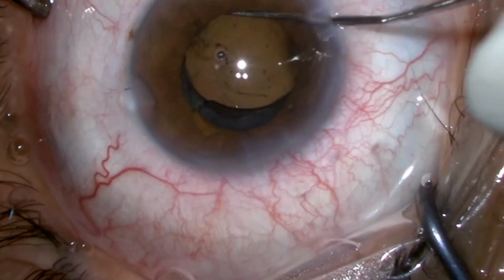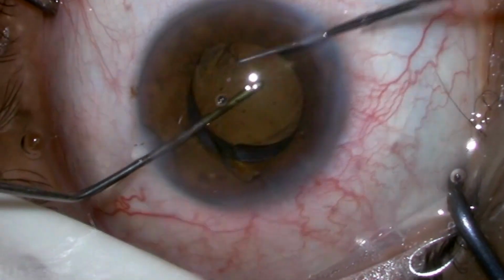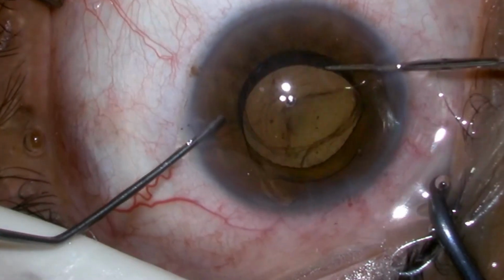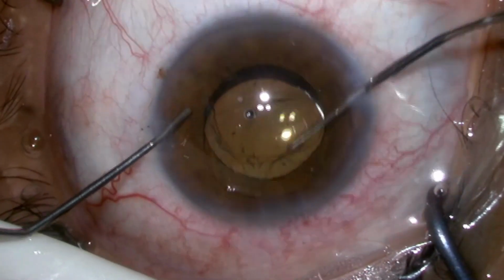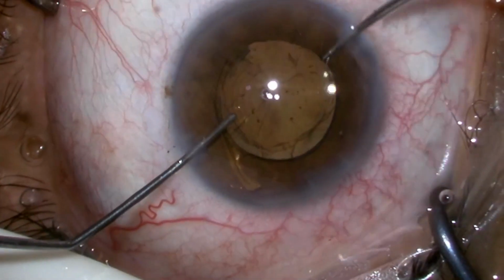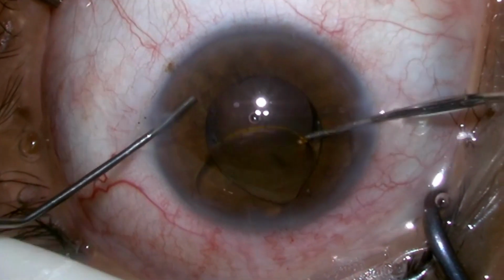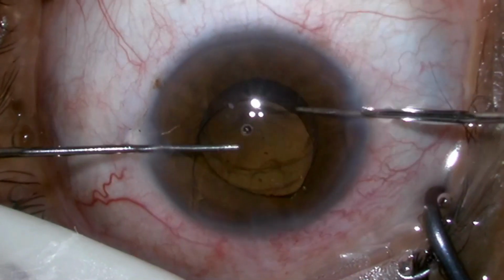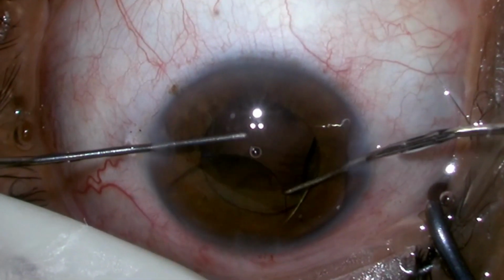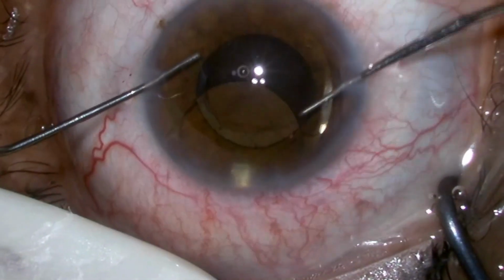Now we are trying to take the second haptic out of the bag. This was relatively free, not badly adherent, and with a little bit of dialing, this haptic is out of the bag.